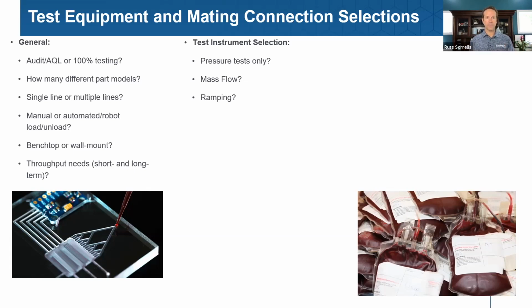That's another tool that you can use and that instrumentation can have, right? Precisely. And as long as we know that up front, we can incorporate those features in. The typical instruments that are on the market from us and from any of our competitors are typically going to be, the initial offering is a pressure-based system alone. And we add to that the capabilities of mass flow.